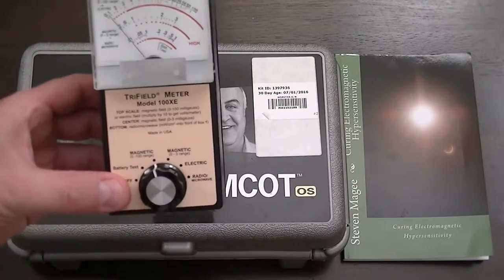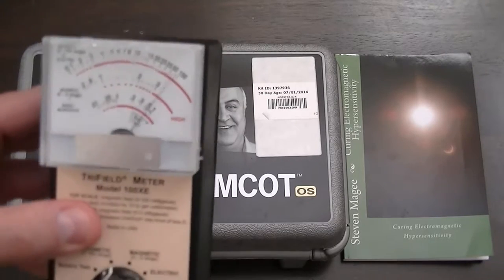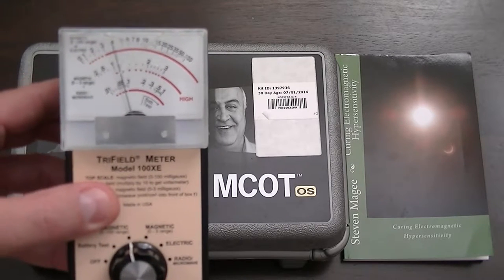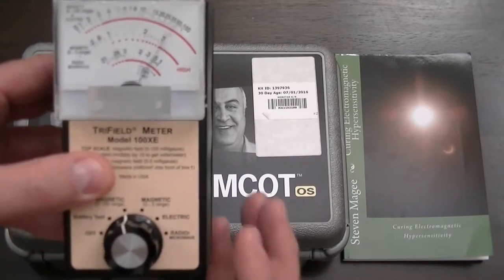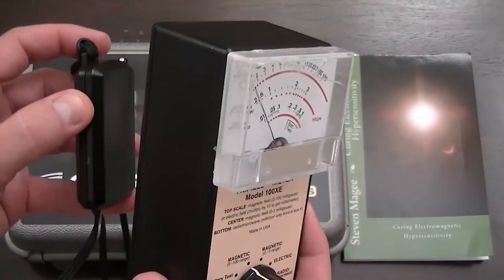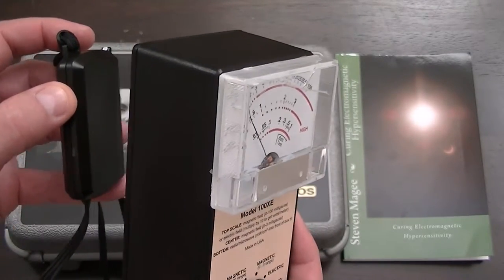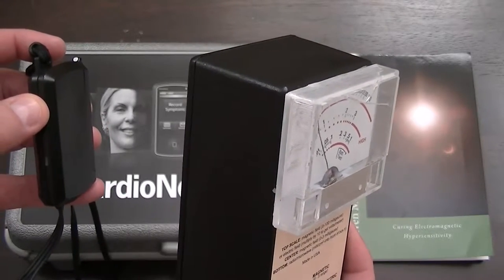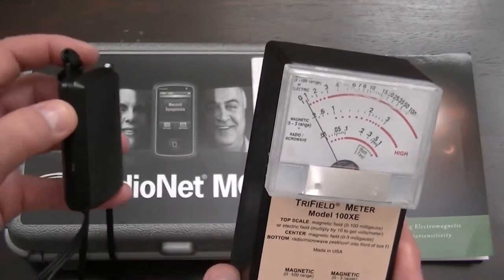I'm going to bring the little device next to it. So there we go — that's what our device is doing. You can see on the 0 to 100 magnetic field range we're getting pulsations. I'm going to lift up this meter and see how far we get those pulsations. You can see the meter is still flickering with a little bit of distance — there's quite a field coming out of this little pendant.